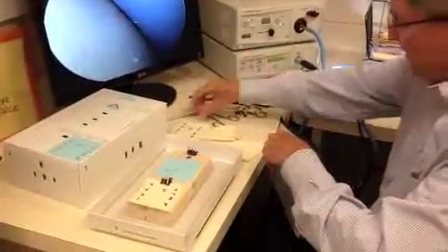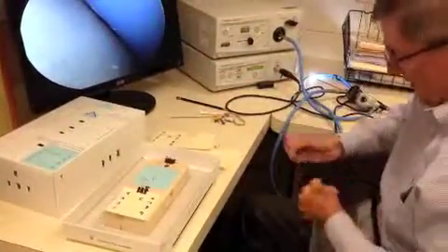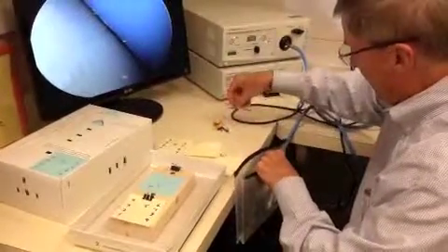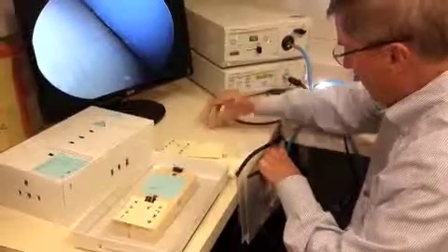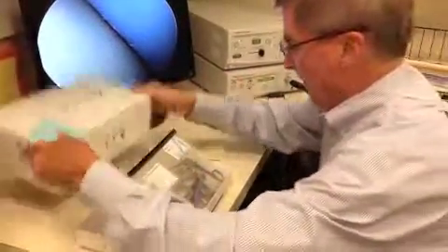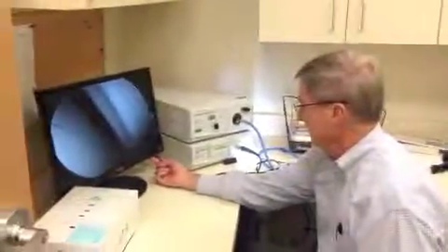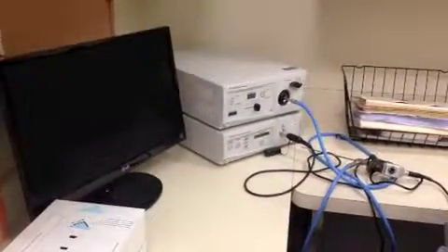We'll put all the instruments back into the envelope and we're done. The final part of the box module is turning the equipment off: turn off the monitor, turn off the camera, turn off the light source, and we're done. Thank you.